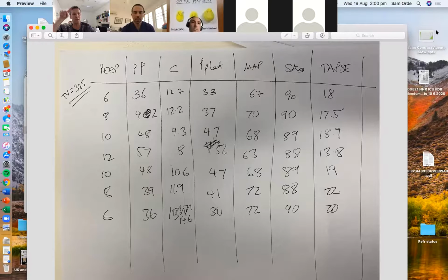The hysteresis thing. I think we're probably right up at the top portion of the curve, even with just going up in 2. I reckon it's like blowing up a balloon when it gets to its maximum amount, it can't go any further. So just small changes in pressure have a massive increase in the plateau pressure. And you can see that it just sort of exponentially goes up even by just going up with 6 on the PEEP. I think Sam, can you hear me?